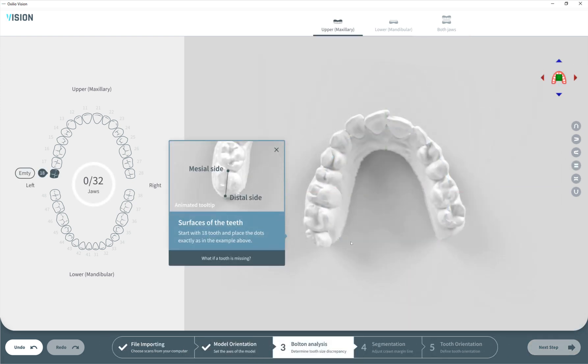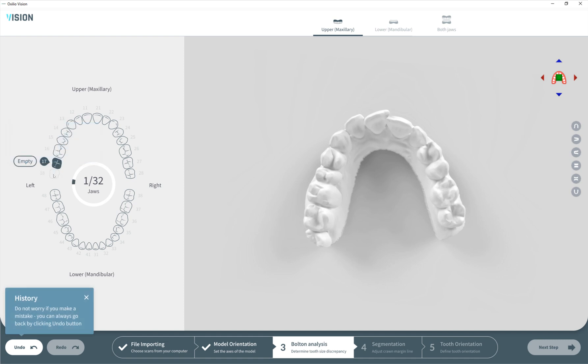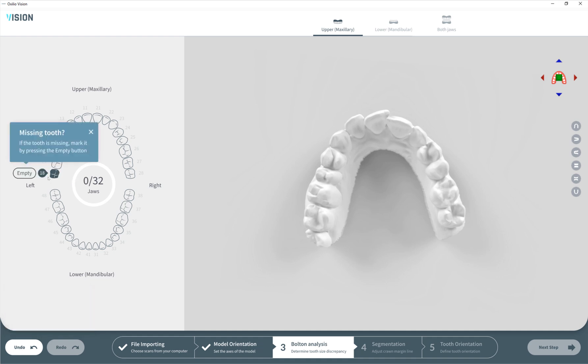Let's move to the next step. Here we need to put two points on every tooth for Bolton analysis. Here's a very nice tip regarding what to do when teeth are missing. By clicking here we can see there's an option to put empty on a selected tooth, so it will be grayed out meaning that tooth is not present. We have a history record here so we can go back several steps and forward if we hit it accidentally.